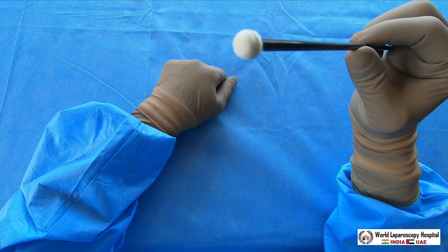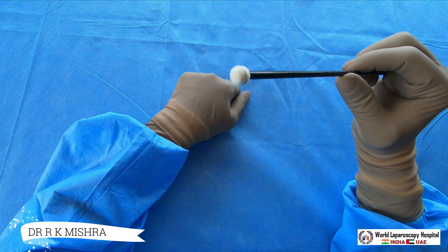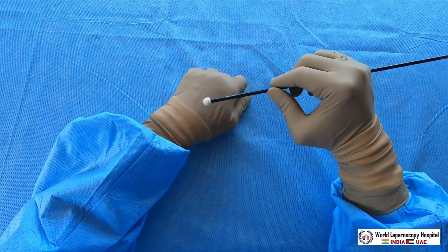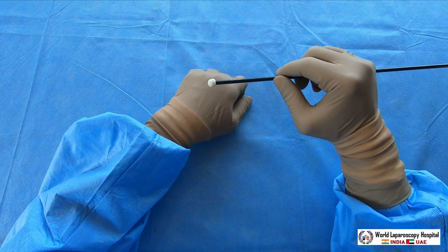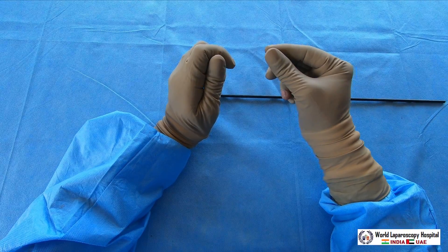You have to discard it because its tip is made of cotton, so it cannot be sterilized and must be thrown out. However, you can use it very efficiently to perform blunt dissection without trauma. As we know, blunt dissection can also be done with a suction-irrigation instrument.